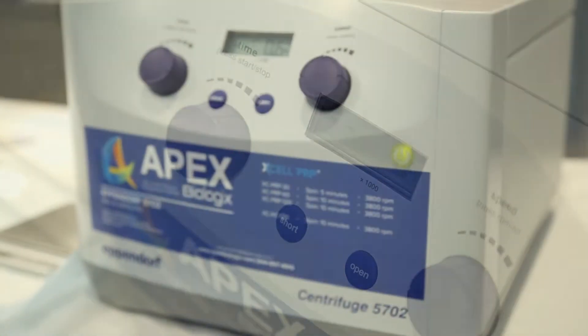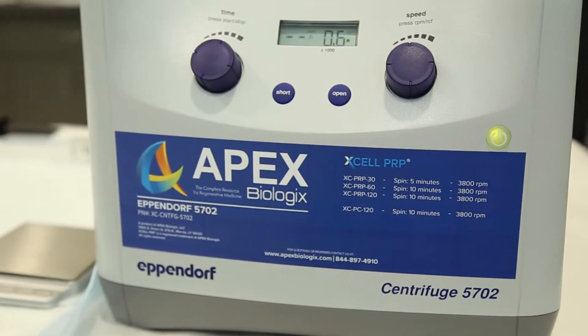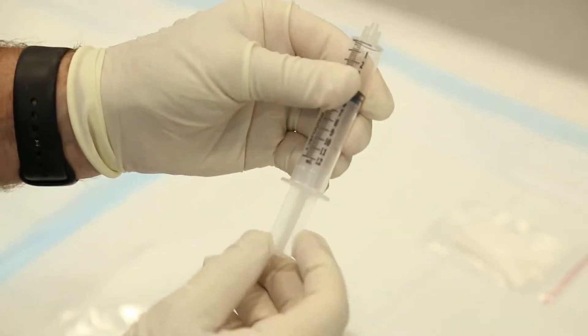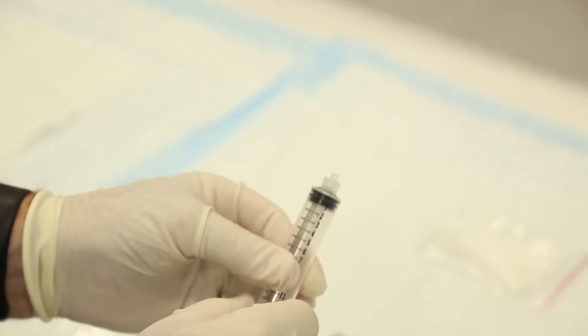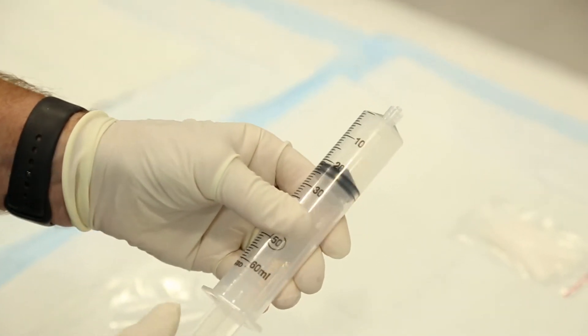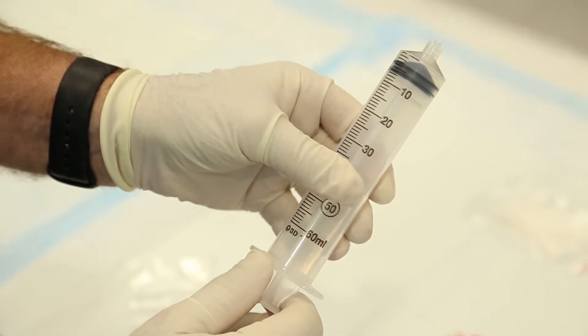While your sample is spinning in the centrifuge, prime your 60 ml and 12 ml syringes. Prime the 12 ml syringe to ensure that the barrel moves freely. Now prime the 60 ml syringe, leaving 5 ml of air in the syringe to prevent splatter.